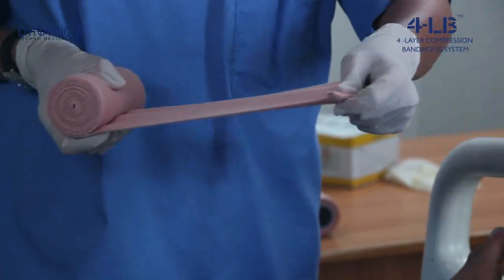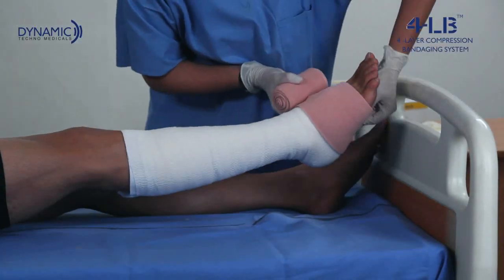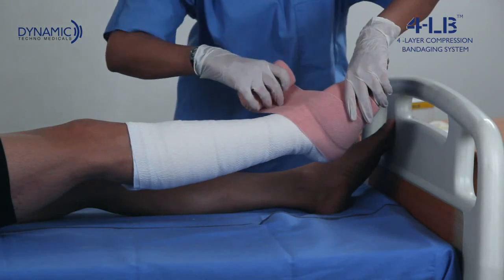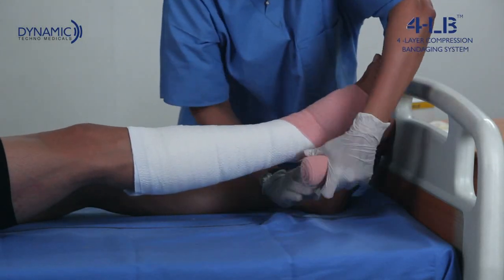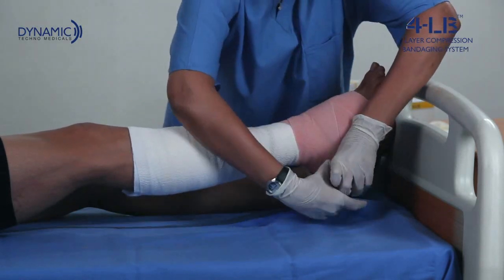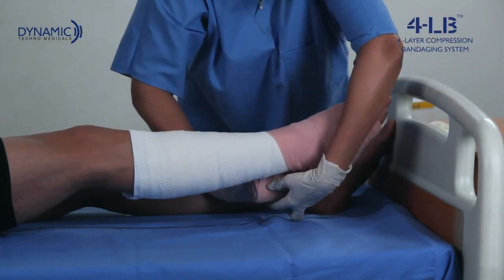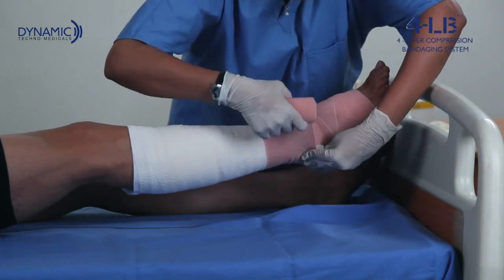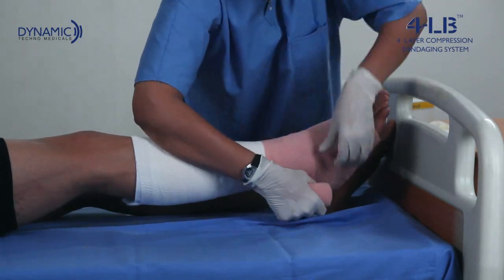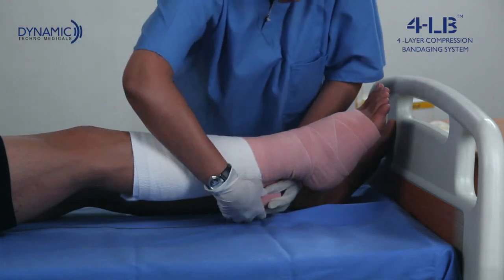The third layer is a medium compression bandage which is applied with a tension of 50%. The application starts from the base of the toe, covering the ankle in a figure of eight pattern. Unlike the other two layers which follow a spiral pattern up the leg, this layer is continued up the leg in a figure of eight pattern — one turn up and one turn down forming a criss-cross design. This is very important. At the top of the limb it is loosened off and no tension is applied to the last turn.